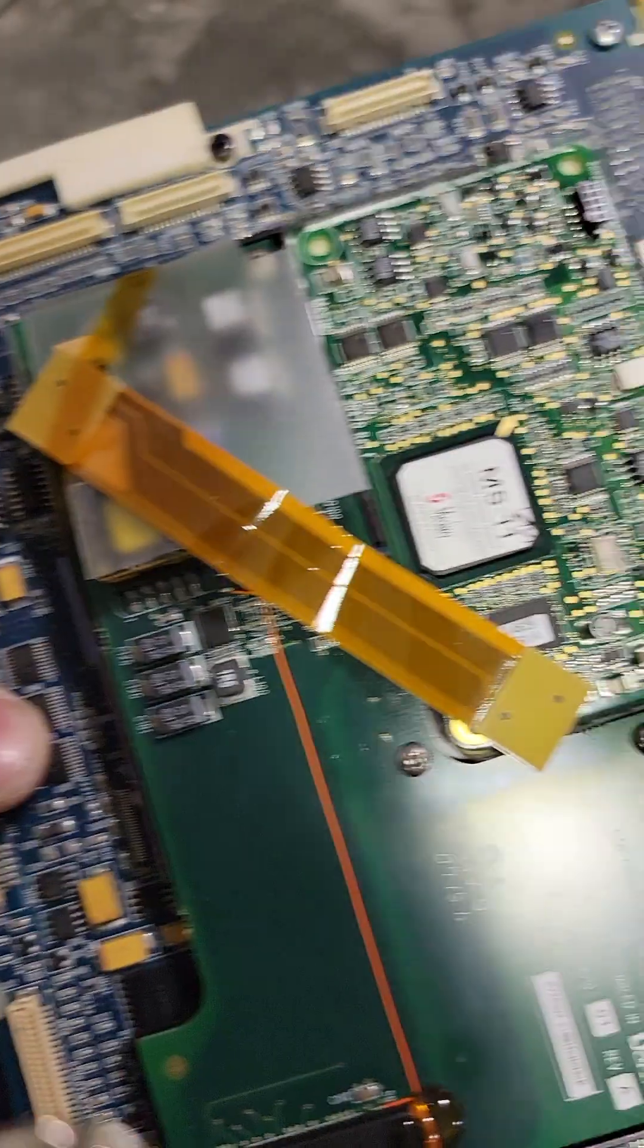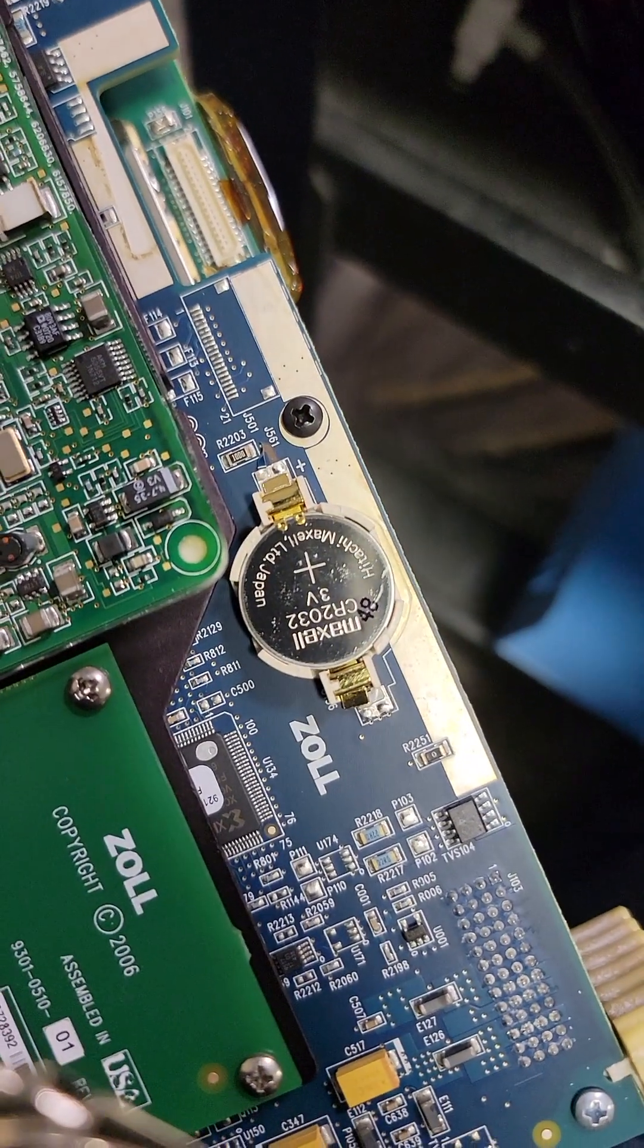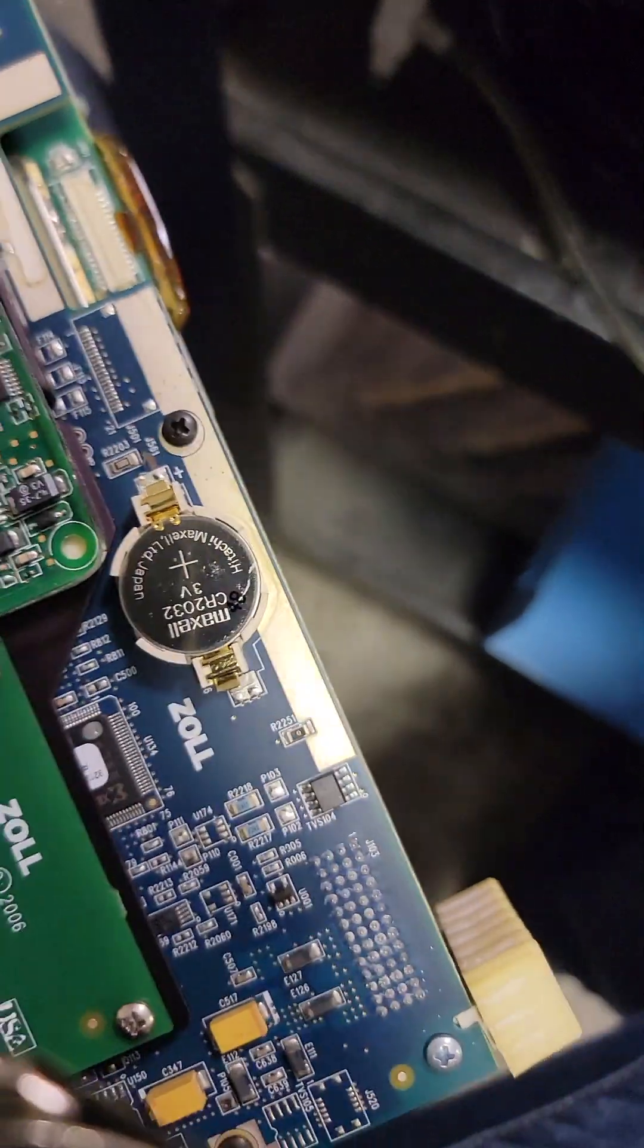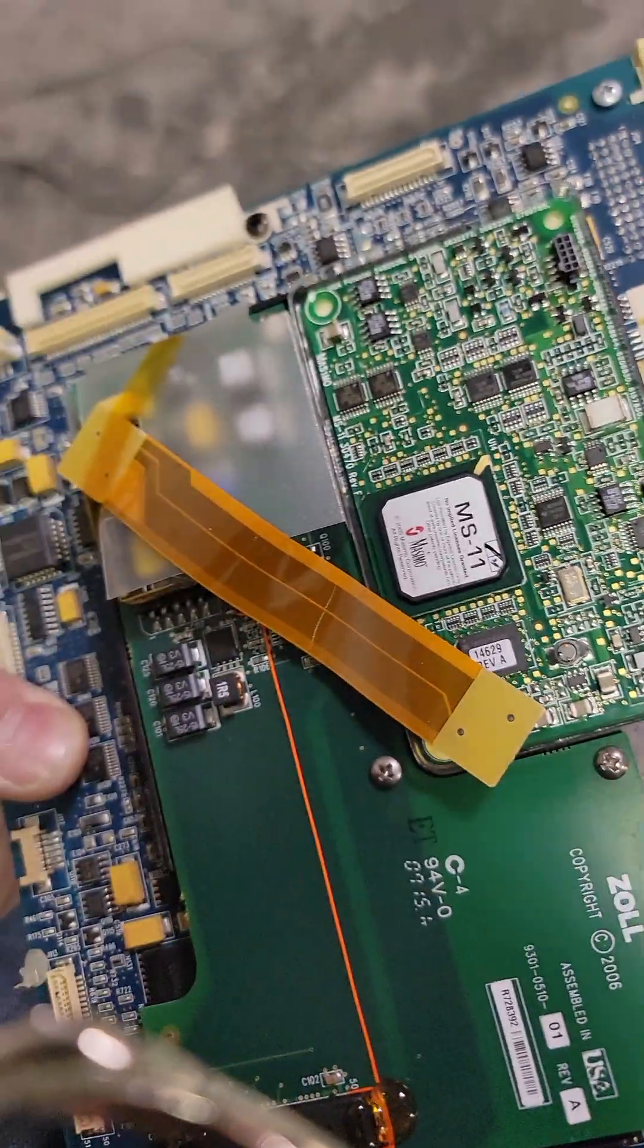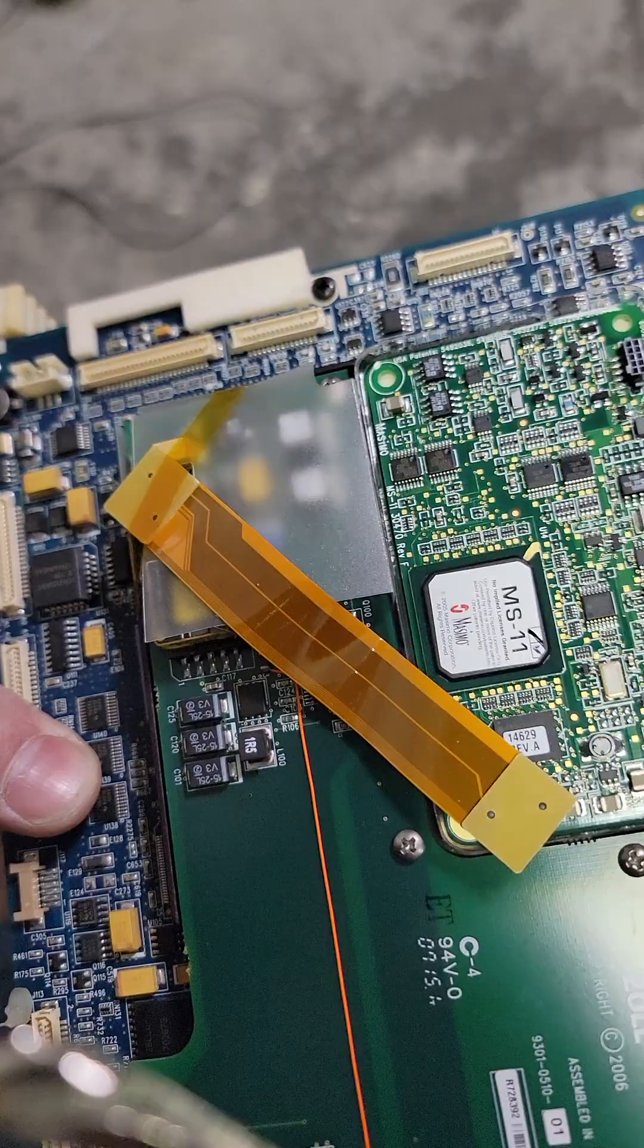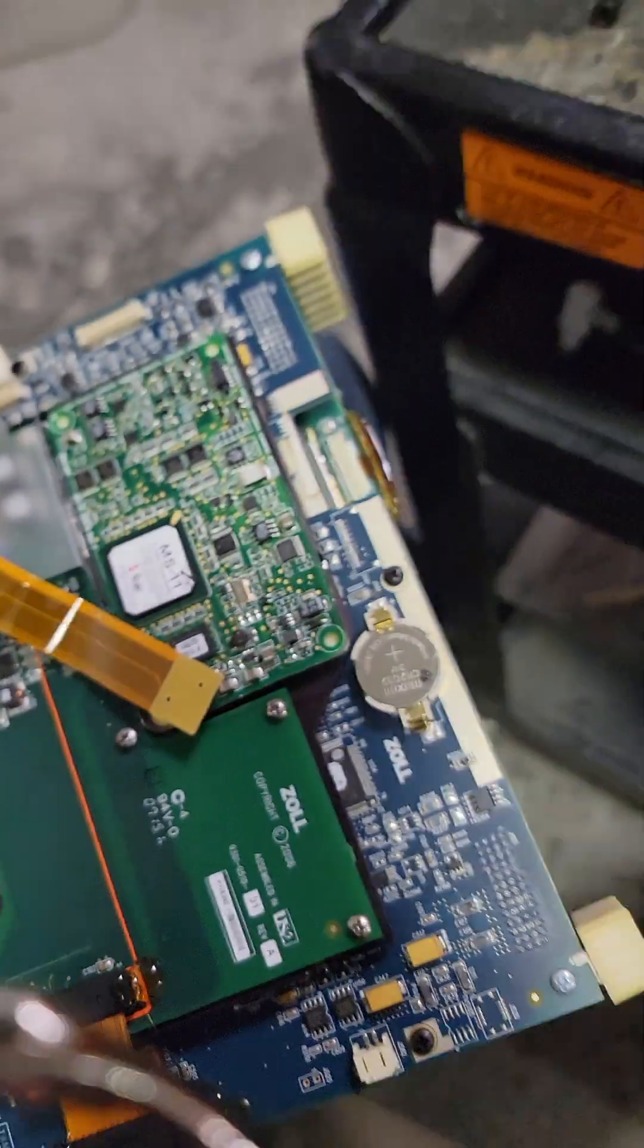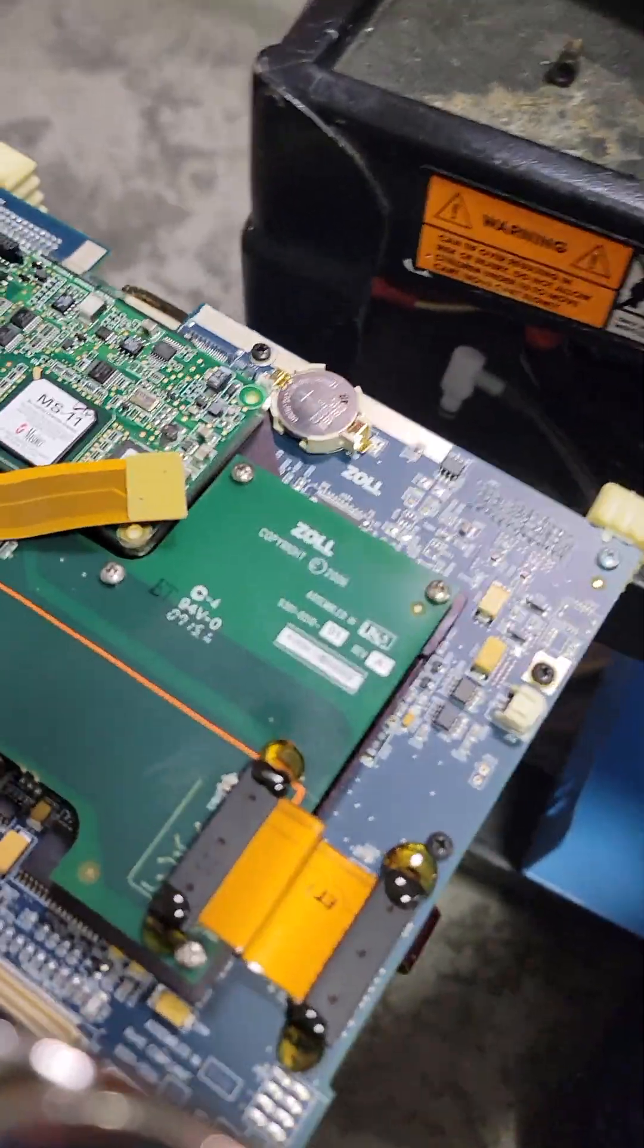And there's our coin cell battery. What a pain in the ass that was. So, to reassemble, just do all that backwards. Good luck. Stay tuned.